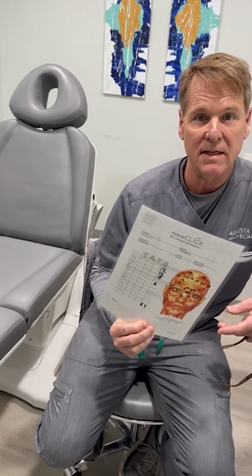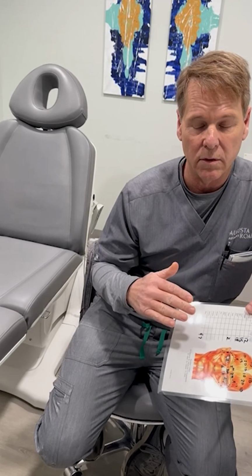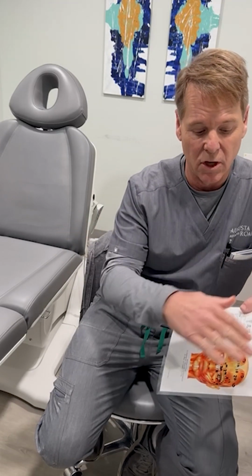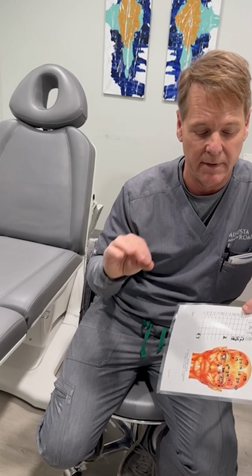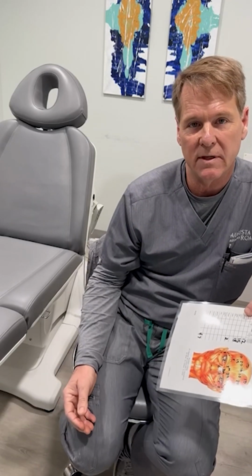Now, I'm not saying you're going to need to do this every time, but this charting is going to allow you to have exact treatment plans. So if patients need something adjusted, you can go by this and you can adjust it by 1 or 2 units to make them happy. Now, I know some of you are going to say, well, that takes me more time.